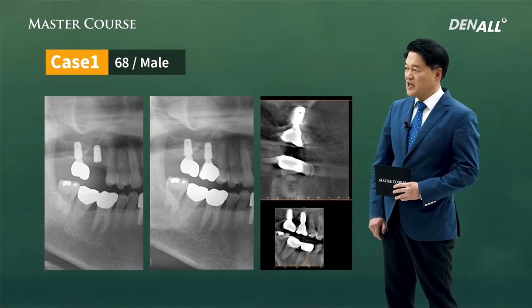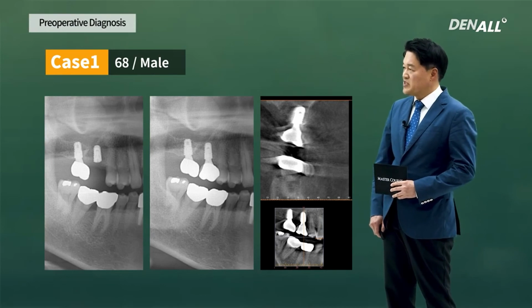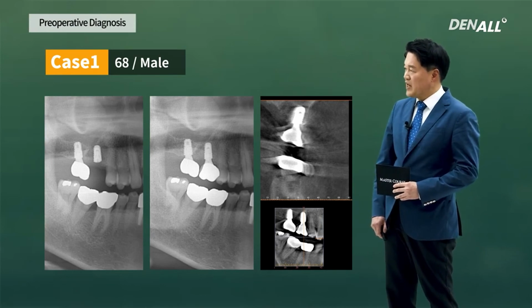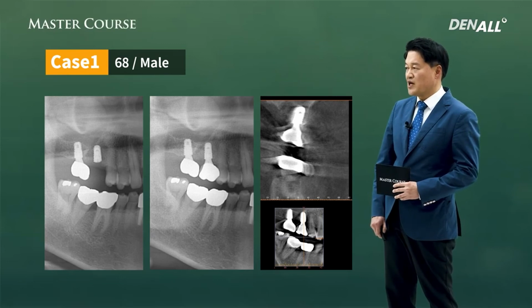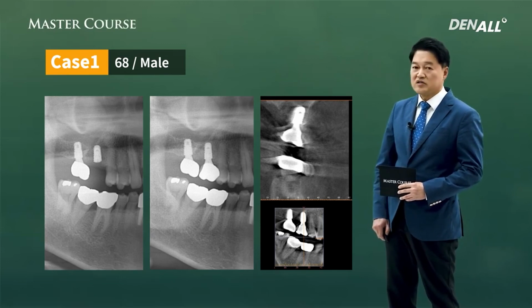This is the panoramic X-ray right after surgery and after prosthesis delivery. If you take a CT palatally, the bone graft is healing nicely. And the implant has been placed in the desired position, and the thickness and the length were what we originally planned.